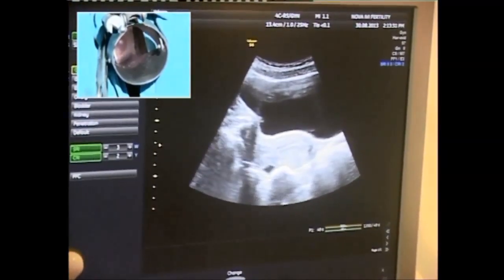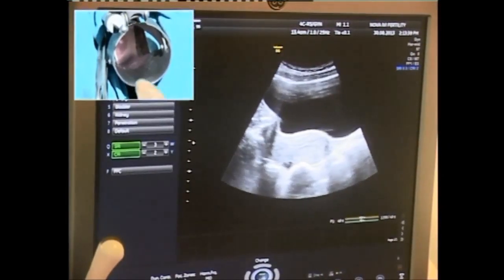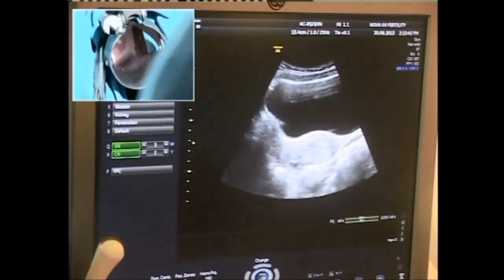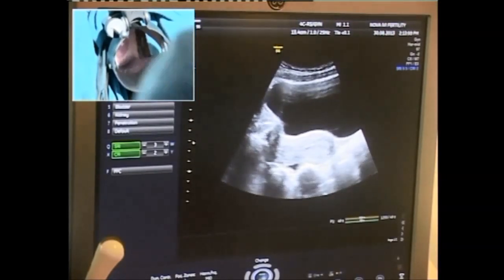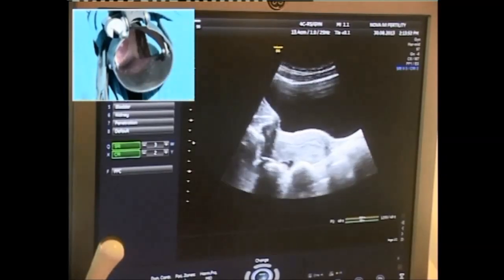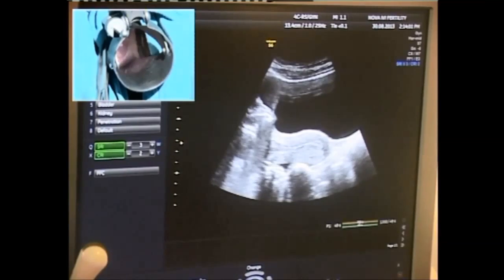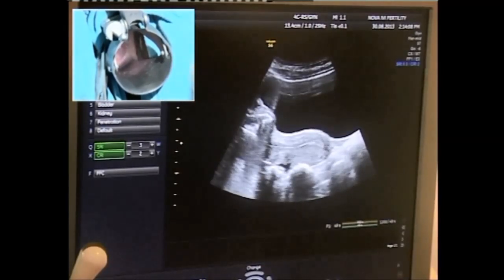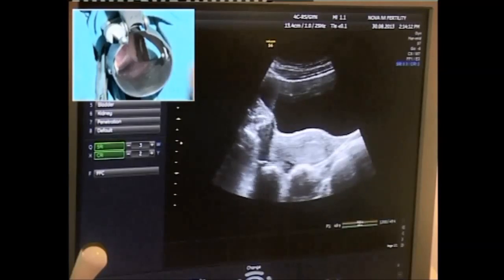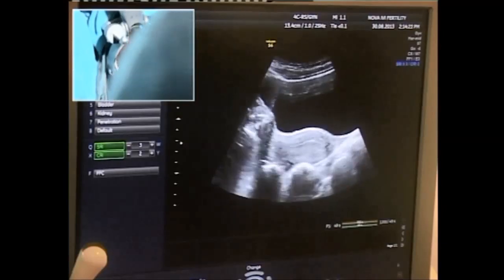I am going to correct the gain of the machine — it is very bright. If somebody can reduce the gain, that will be great. We need to show inside and again we are cleaning with saline. There is a lot of discussion over whether media needs to be used, whether it helps or does not help. I typically don't use media. I clean it thoroughly with normal saline, dry it completely, and remove the mucus as much as I can atraumatically. You have to be very gentle and handle it as little as possible.